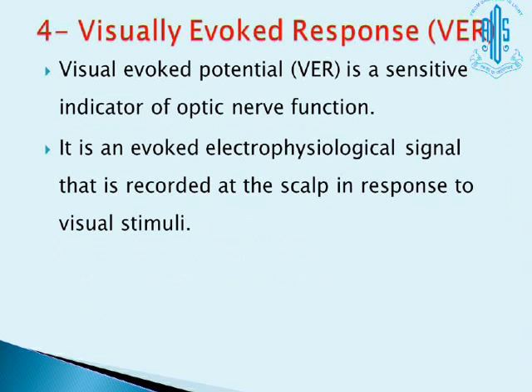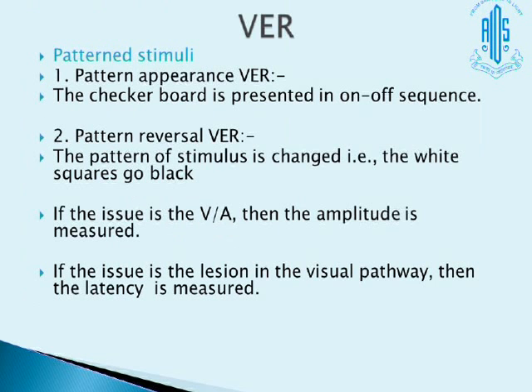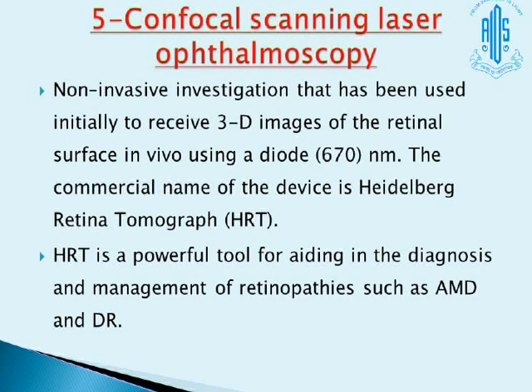Visual evoked response, I think we don't rely on it very much. We have a flash of light and pattern stimuli, pattern appearance, and pattern reversal. Now we come to confocal scanning laser ophthalmoscopy, that is HRT.